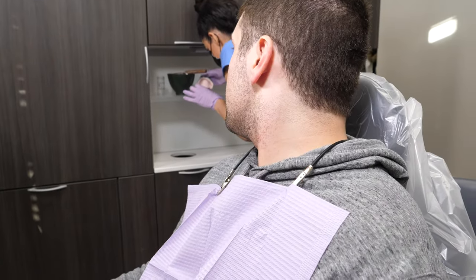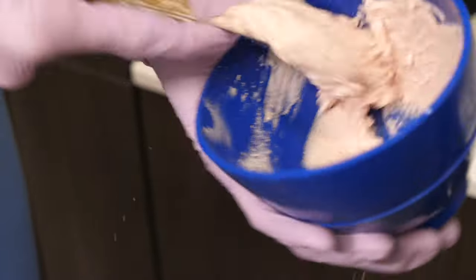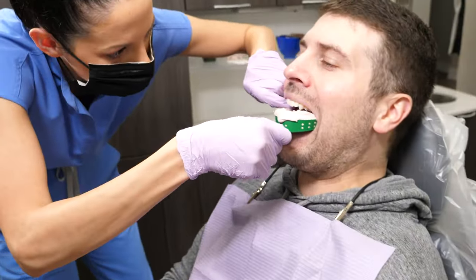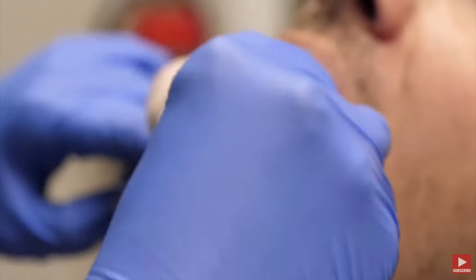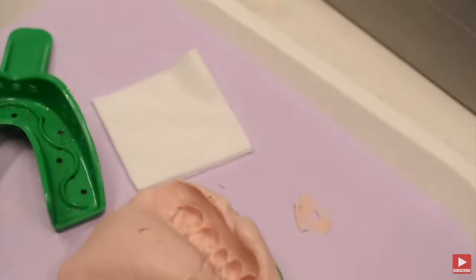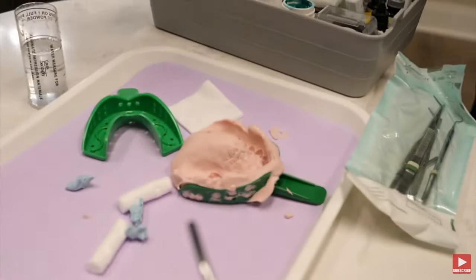After they're done with the top, they will do the same exact thing on your bottom teeth. After that, they will clean you up again. Once they're done with both the top and bottom impressions, they will bring the impressions back to the lab and make the trays for you. It's quite a process, so they usually wouldn't get them finished on the same day.